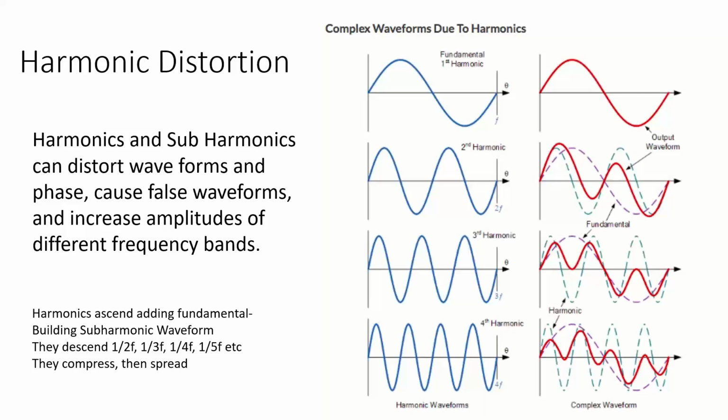So let's just quickly get into harmonic distortion. I won't get into this too much, but just to give you an idea again of how everything gets distorted with EMG and how complex the whole topic is. Here's a sine wave, and that might be one motor neuron. Then you get another motor neuron, and they don't always fire at the same rate. We'll show you that in a minute. And then another, and then another.